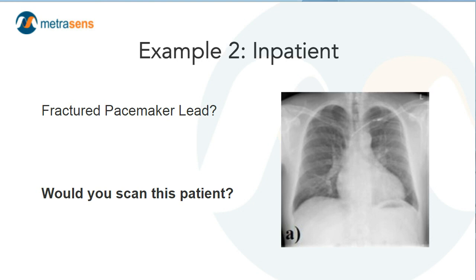I'll constrain the scenario just a little bit to hopefully make it easier for you to give a definitive answer. So the patient, we're scanning the patient's knee, and this patient has this abandoned pacer lead. And so I'll ask you the exact same question that I asked you with the BB.